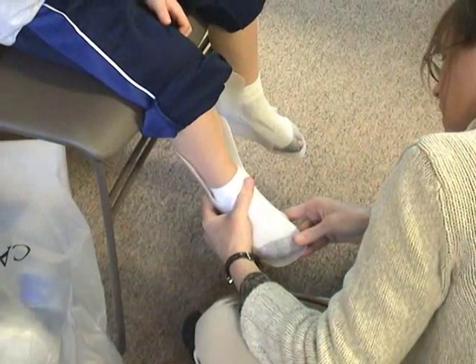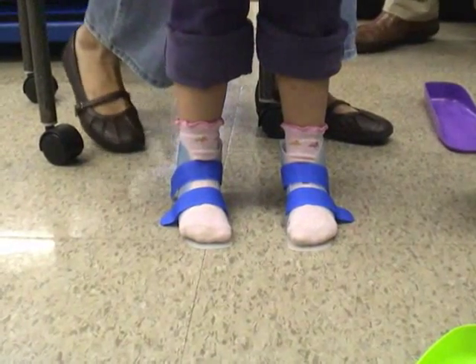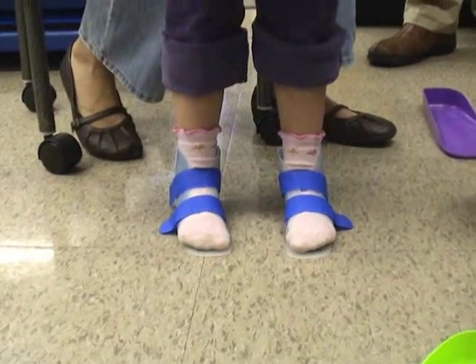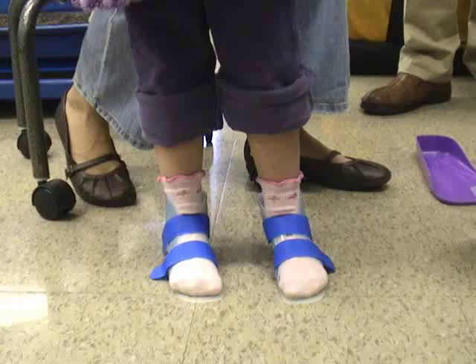The second thing to look at is length. The toe shelf will often be a little bit longer than the patient's foot — probably a half an inch — when, with the heel seated, the overall length is correct.